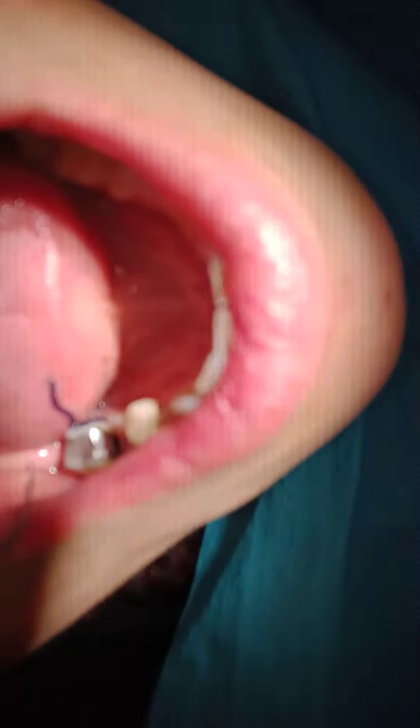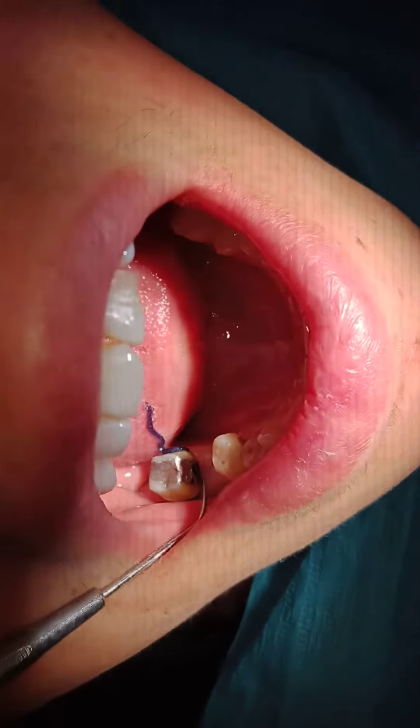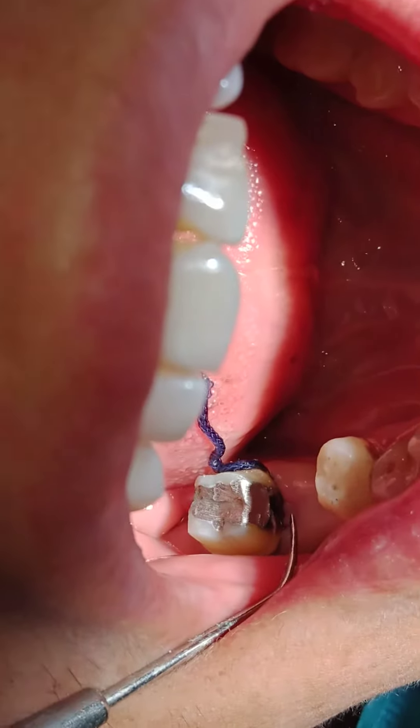Asalaamu Alaikum. This is a case where the student was faced with an amalgam filling. She was asking: how much do I go mesially on this tooth? Do I go subgingival or not? And how much do I reach?